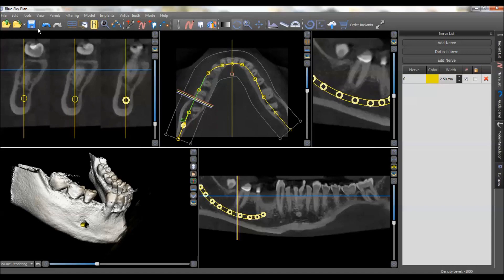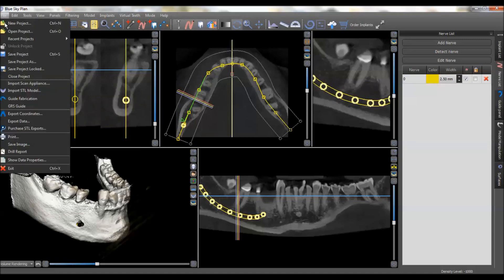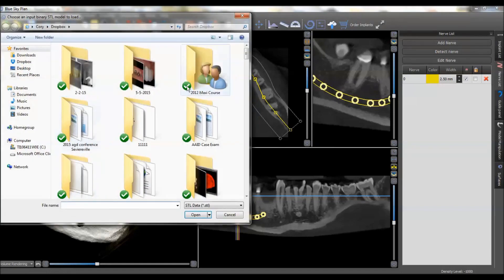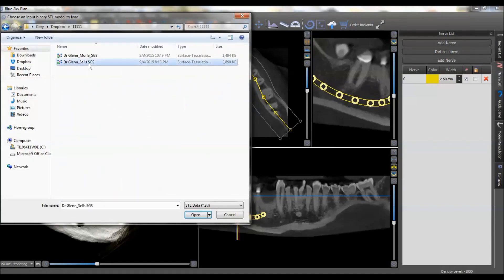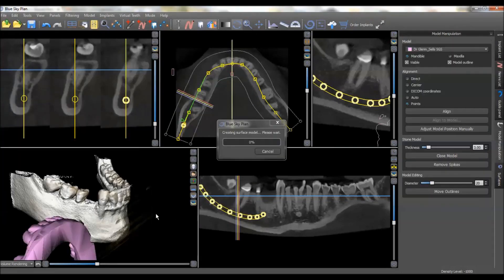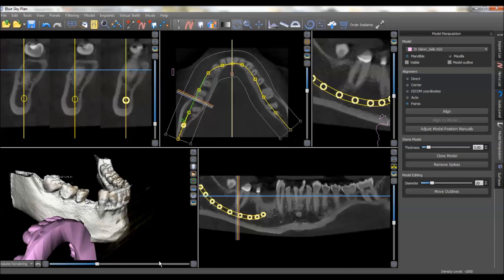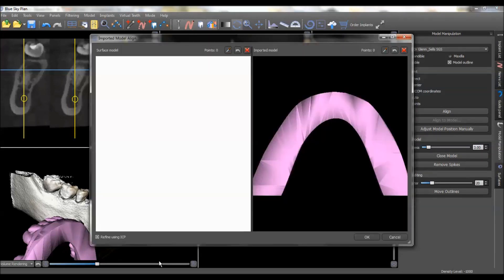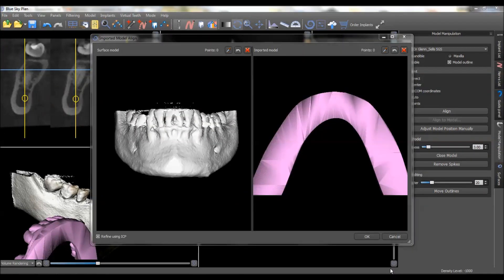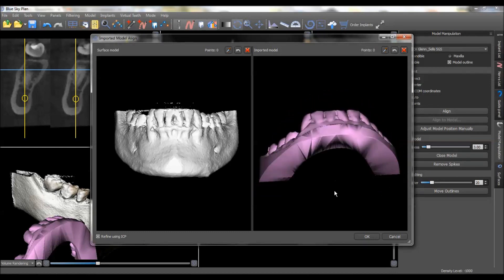At this point we would import the STL model, so we'll come up to File > Import STL Model, go to wherever you've got the patient's STL model saved, and as you can see it pulls this model in and drops it down here in the lower left-hand screen.